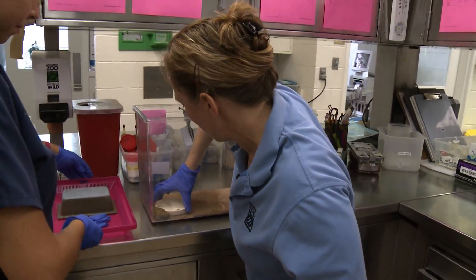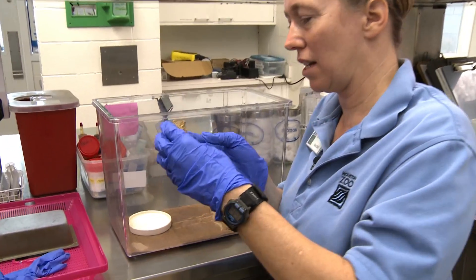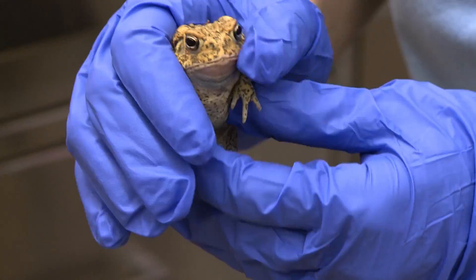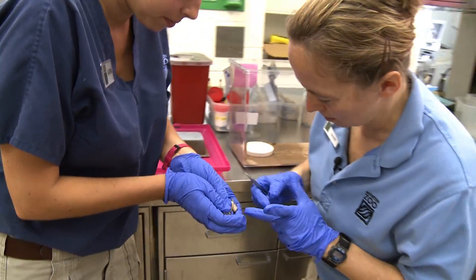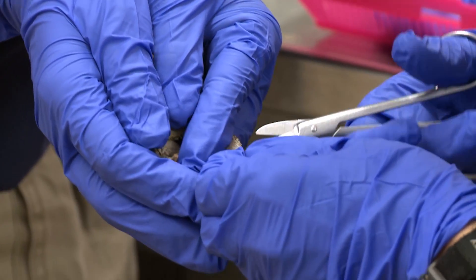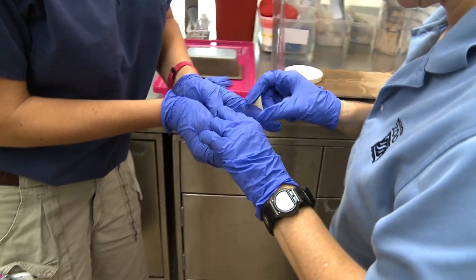Here's our toad patient — several weeks ago we did surgery to remove a cancer mass from his left rear foot. He has three sutures I need to remove today. You can see we took two toes off. Karina is going to hold the toad and we'll take those little sutures out. This particular toad is apparently a little shy — the keepers don't see him move much, but every time they leave and come back he's in a different place. And there we go — sutures out.